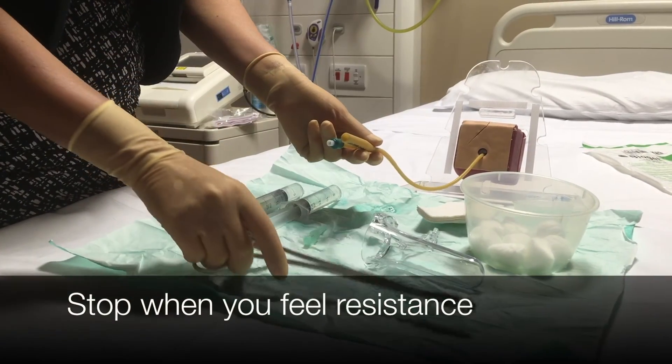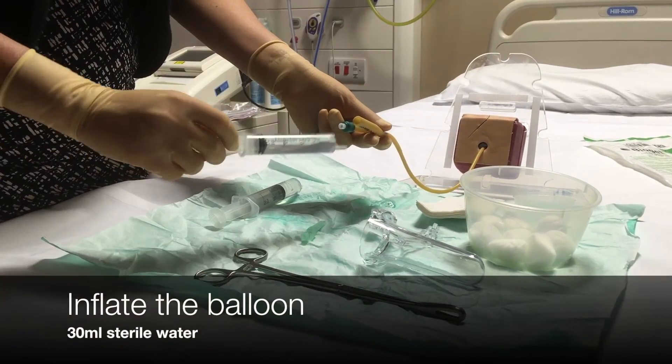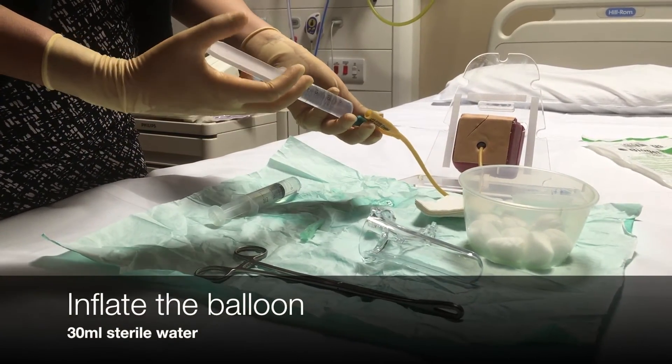Eventually you'll feel some resistance. Once you feel that resistance, you're going to want to inflate the balloon with the sterile water that we've drawn up previously.